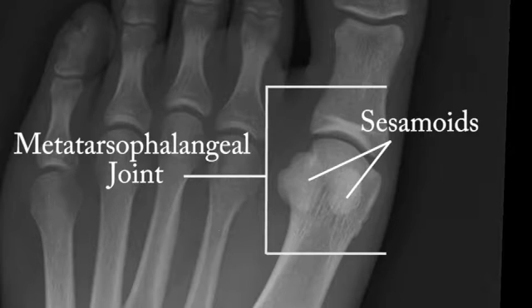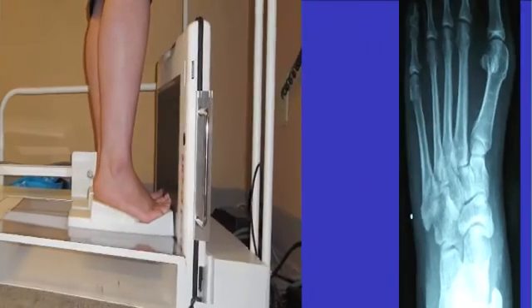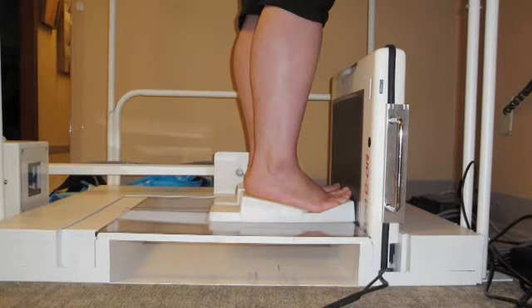Certain mechanical and structural deformities can be diagnosed depending on where these bones are sitting under the joint. A very common deformity is that of hallux valgus, or more commonly referred to as bunions. When a patient comes in complaining of pain in their bunions, this is a view you will need to take. It will often replace the third oblique view of a normal foot series.